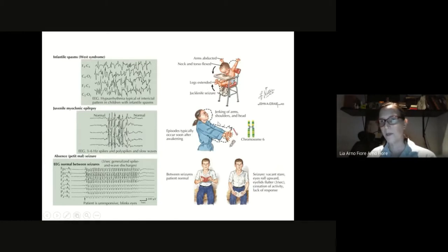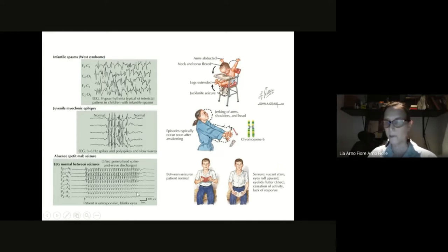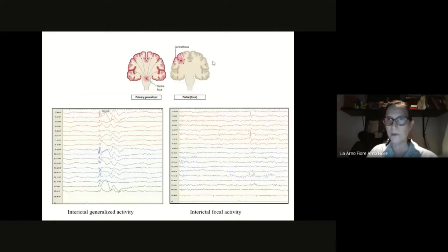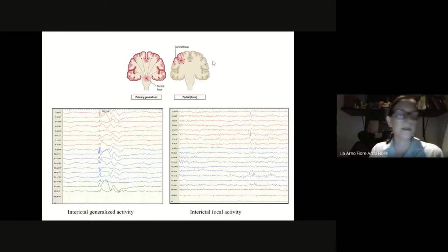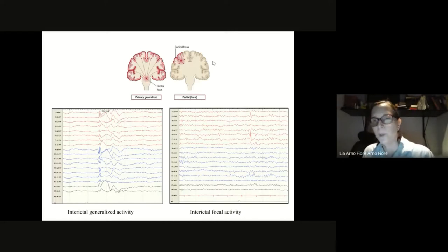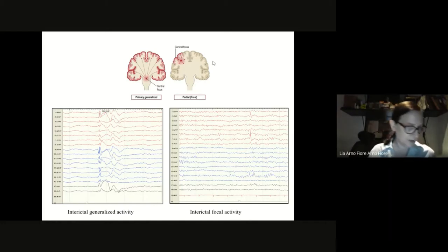With absence seizures, the patient just has a vacant stare — the eyes may flutter — and there's this very characteristic 3 Hz spike-and-wave that begins and finishes very abruptly. It's always important to know what the patient has before you see the exam. It's like a jigsaw puzzle: you have to put together the EEG, the imaging, and the clinical features to arrive at a diagnosis.